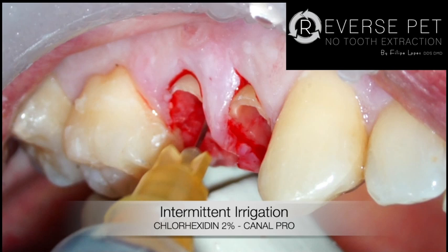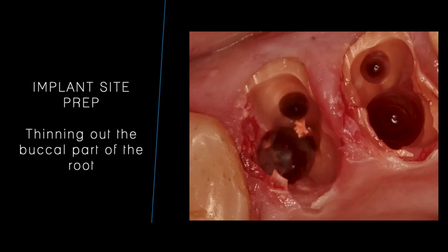And you can see that we are thinning out our shields. They are already almost destroyed because of implant site preparation. That's the advantage. So as we're doing so, you can see one of the initial images of this is that we are starting buccal prep to destroy the remaining shield. Well, a big part of it was already destroyed for implant site prep, I'm sorry.